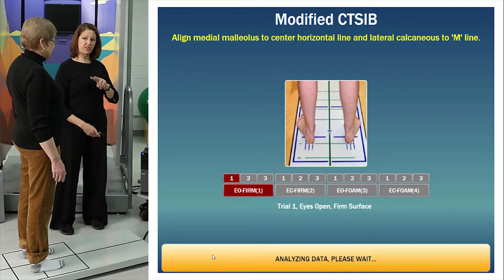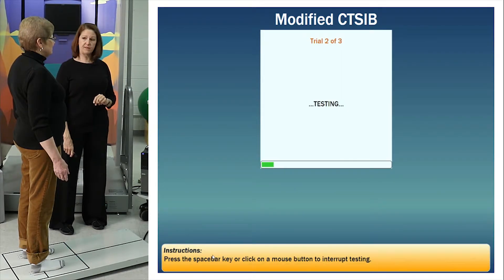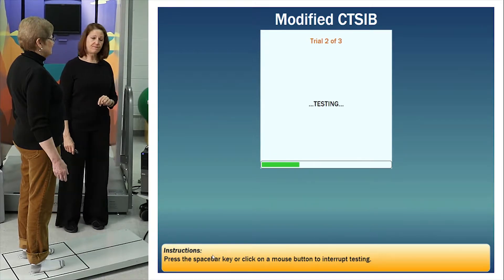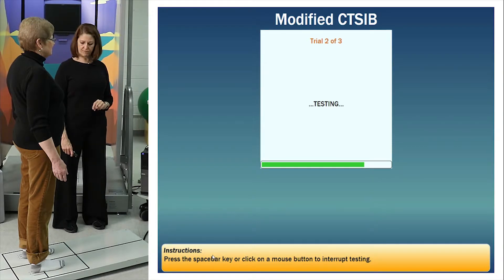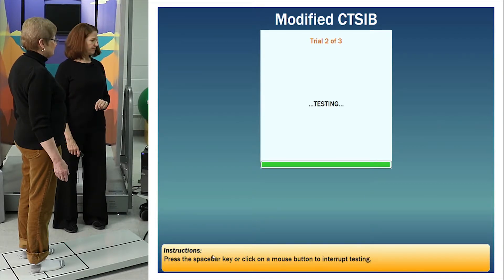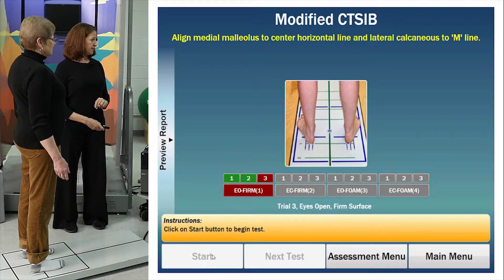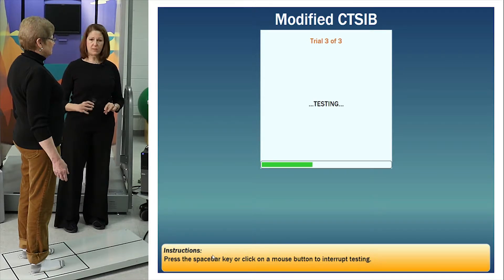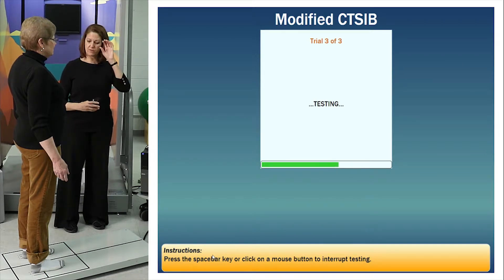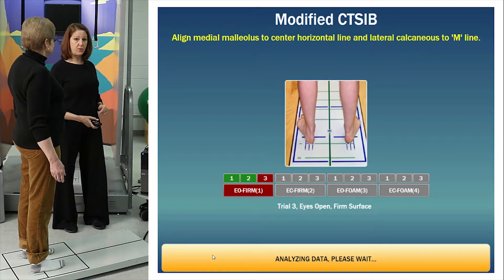Stand really steady, arms relaxed at your sides, eyes are open — stand steady for about ten seconds. Good. You get two more just like that. This easy condition allows our patients to balance with vision, vestibular, and somatosensory information all available for balance, and it gives us a baseline for the other three tests.